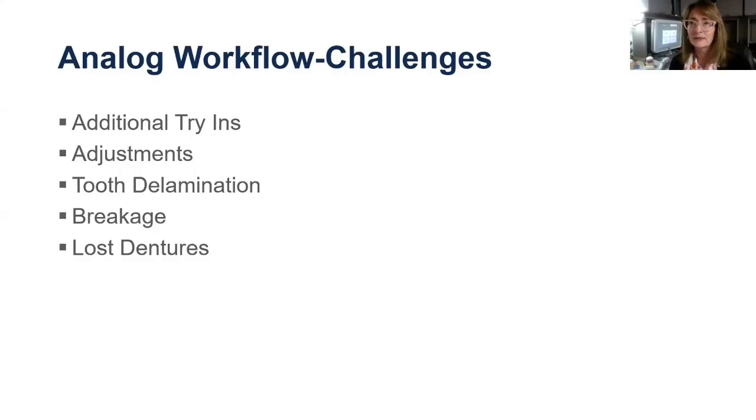Back in the day, the dentist I worked for would say, I'm going to be married to this patient for the rest of my life. It's a common theme out there. Tooth delamination. It's a thing, right? Sometimes a denture tooth will pop out of the denture. It's exciting to see that that's no longer a concern when it comes to the printed digital dentures.